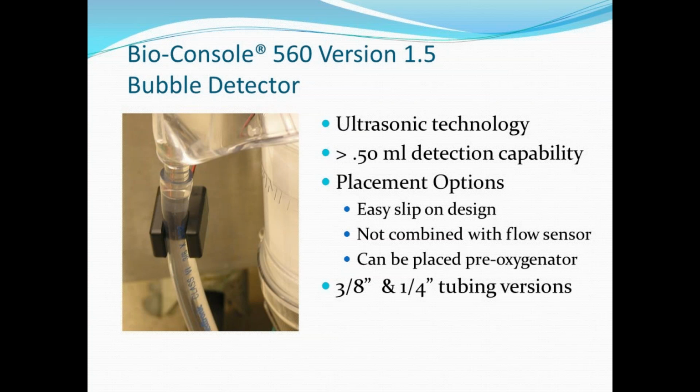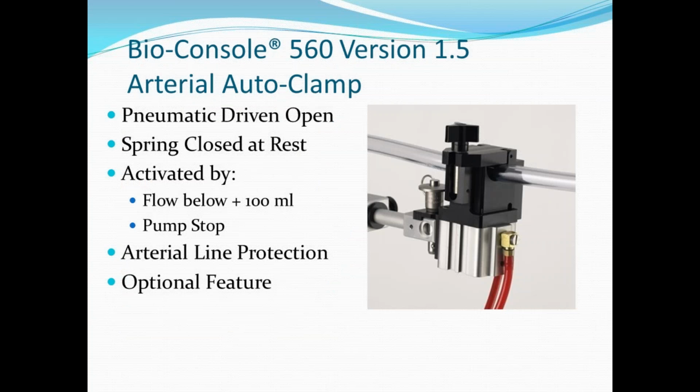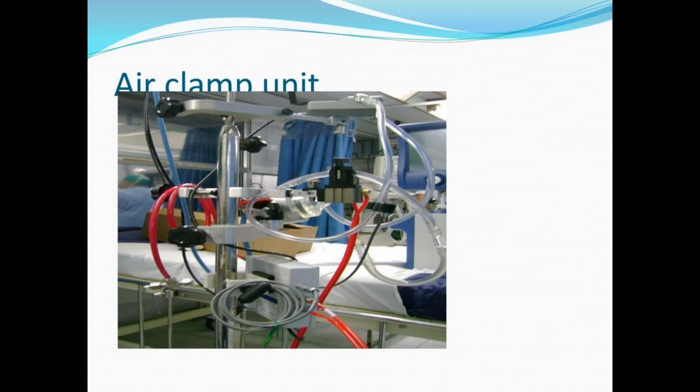This is an auto clamp, it's available in the machine. Moment the bubble detector detects a bubble, the auto clamp goes on. But that is what used to create problems with bubble detection, and that's the reason we stopped using this. This is the auto clamp unit.